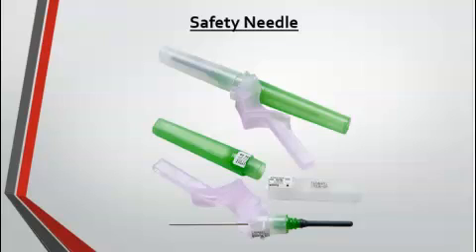The last thing of note on these images are the safeties themselves. These purple structures hanging off the edge of the needles are the safeties. The safeties are immediately activated after the venipunctures are completed. So let's say you pull the needle out of the arm, and then you're immediately going to push the safety up on the needle so the needle is no longer exposed. And we're going to use a hard surface to activate these safeties. The purpose of these safeties is to prevent an accidental stick by these needles.